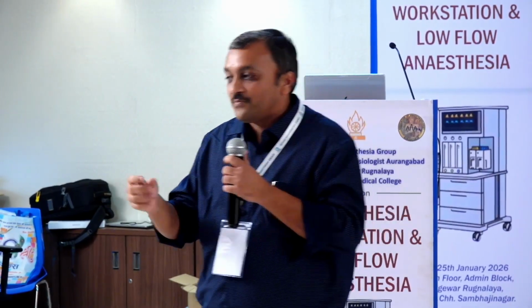If you are giving an expiratory time which is not sufficient... 1:2 is not a magic number. First and foremost, I would like to say there is nothing like a fixed 1:2. You can change it as per the patient. Second thing is, whichever drugs we are using, they all have a tendency to cause some amount of bronchospasm. As sir was saying, we are bypassing our natural humidification mechanism. We are using dry gases, and that too not at a low flow, at a 2 to 4. So you are expecting some amount of bronchospasm. That small bronchospasm is going to cause you a lot of auto-PEEPing. Over a period of time, it will keep on increasing.